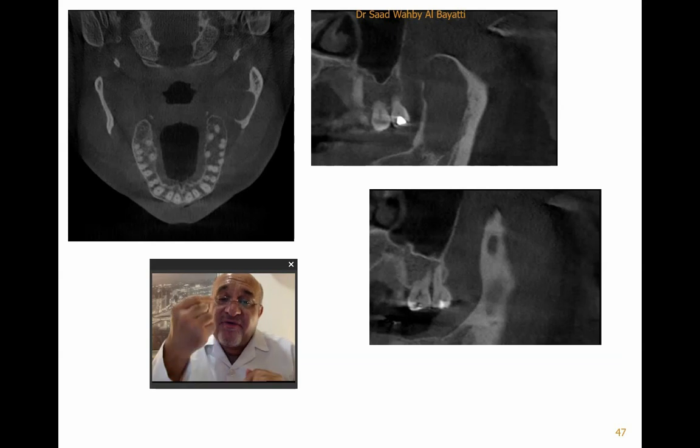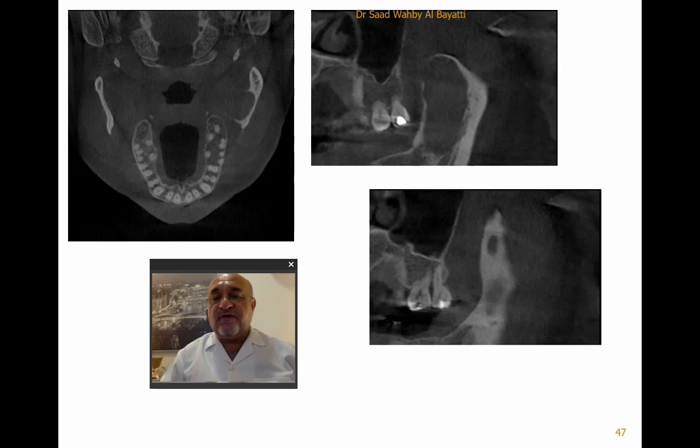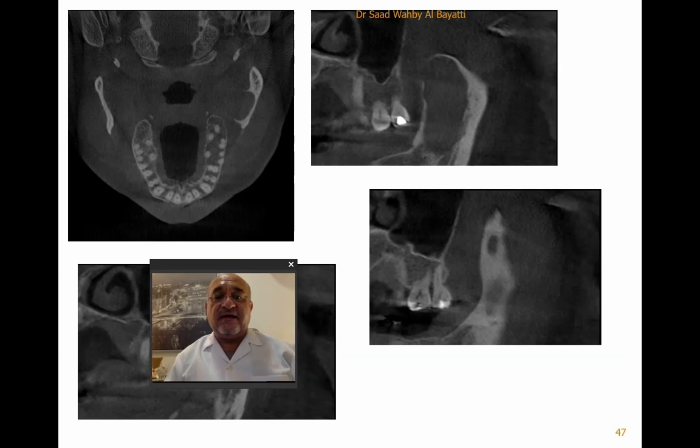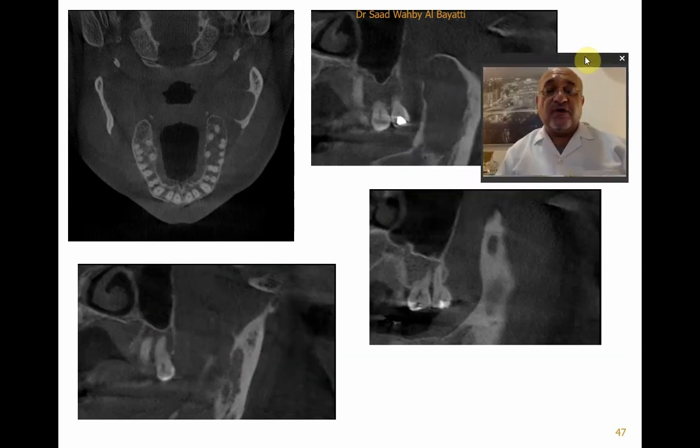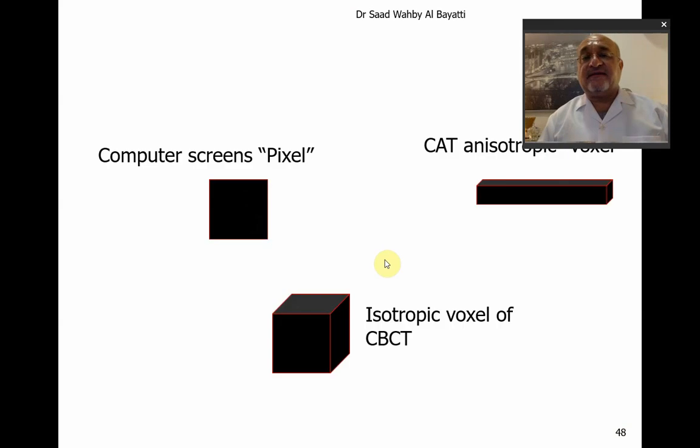But if you go for a thinner slice, you can know, even within those 3 millimeters, where the extension of the lesion is. And here you can see the lesion. See the difference? This is the most lateral, this is the most medial, and this is the widest thickness of the lesion. So you can know exactly where the lesion extends.